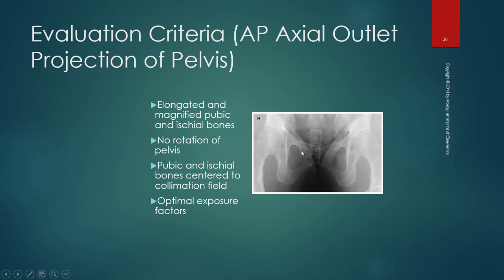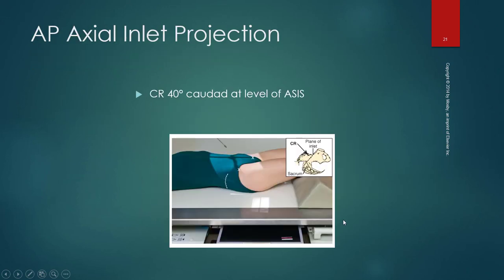See how your obturator foramina are now elongated, and they're going to be magnified. You still won't have any rotation of the pelvis, but it does a nice job of opening up this region of the pelvis. Same technical factors.